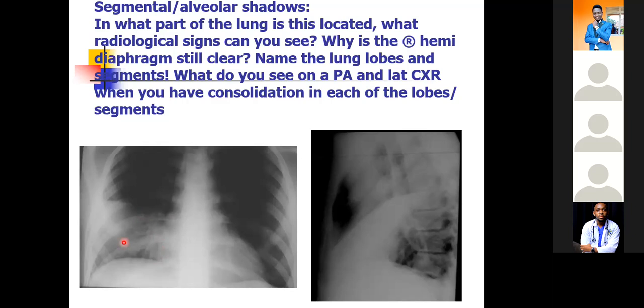We don't easily appreciate the air bronchograms, but of course there's just one which I can easily point out there. This is on our PA projection.